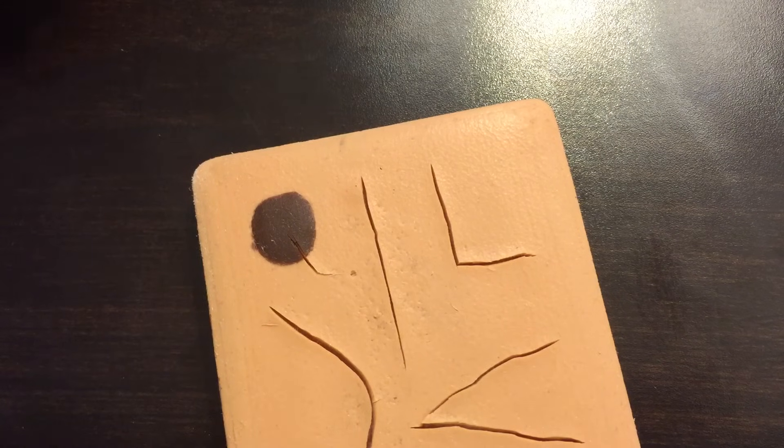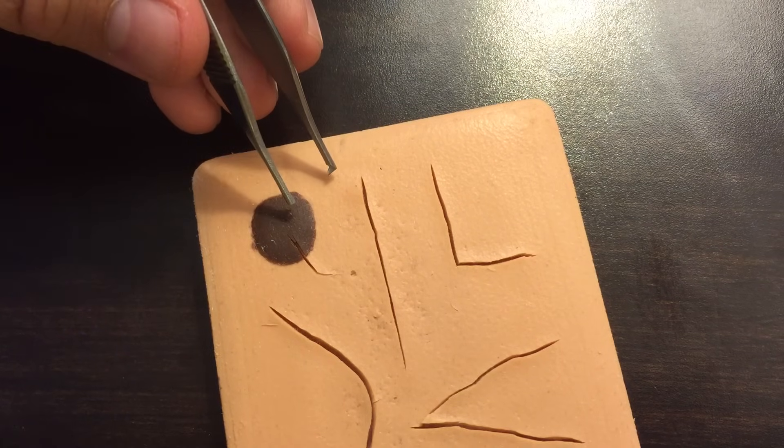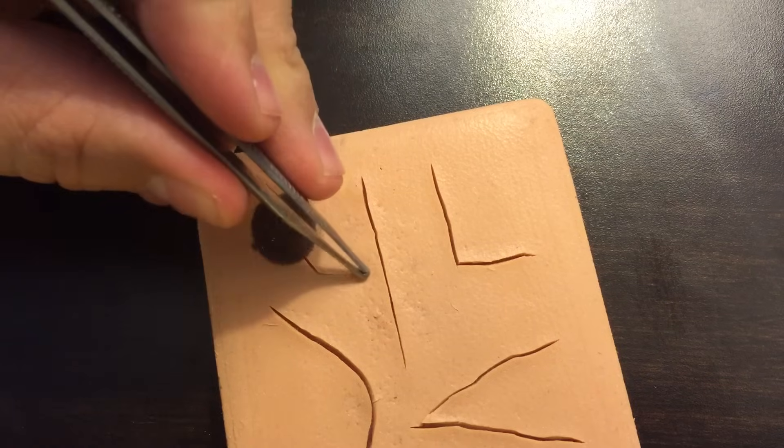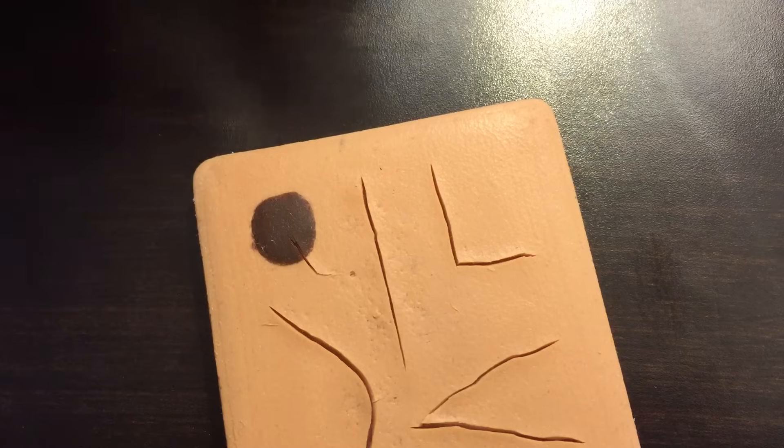I'd like to demonstrate very quickly a simple interrupted suture. It's a good basic suture for simple lacerations like this where there's not a lot of tension.